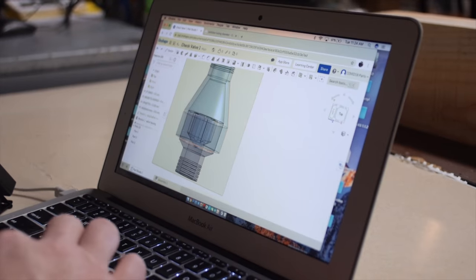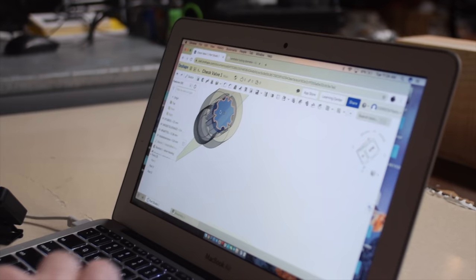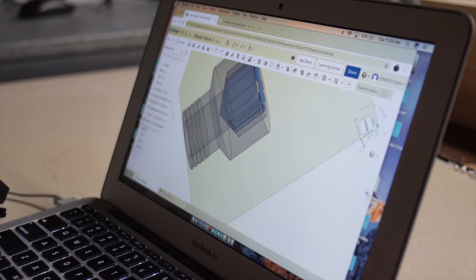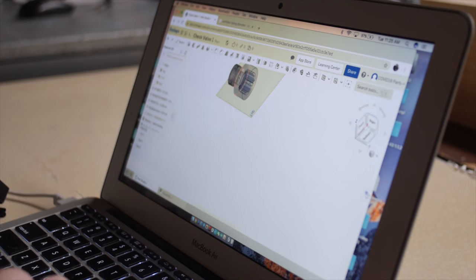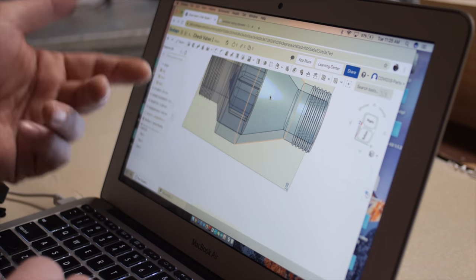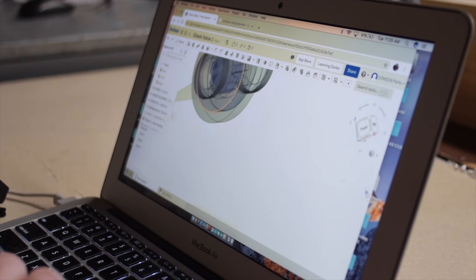I still need to put the threads on the outer and the inner valve body, but basically, if I remove this top of the valve, this is a plug with a conical top over here, and this conical top matches the angle of this conical section over here. This plug can slide up and down in these tracks, and so when air pressure is moving this way, it will plug, hopefully, this orifice. And when air pressure is moving this way, it pushes the plug away, and this plug cannot plug the part of the valve body over here. It will hit the side walls, and air can flow around it. So this should be a reasonably working one-way valve. But I'm just going to put some threads so that these two can screw together.